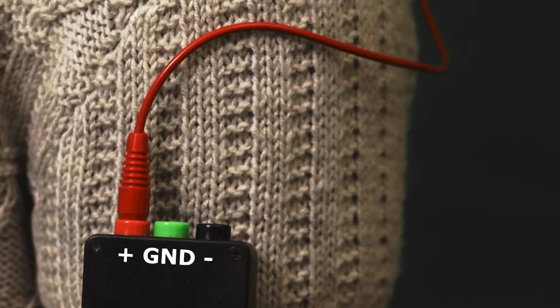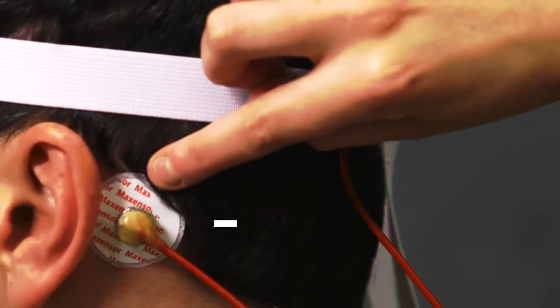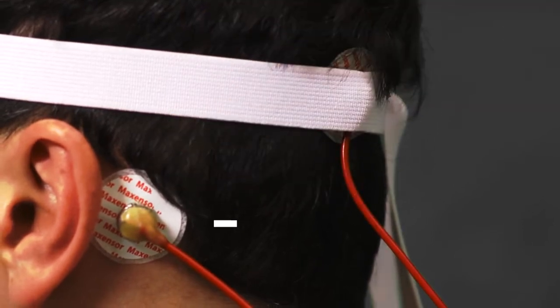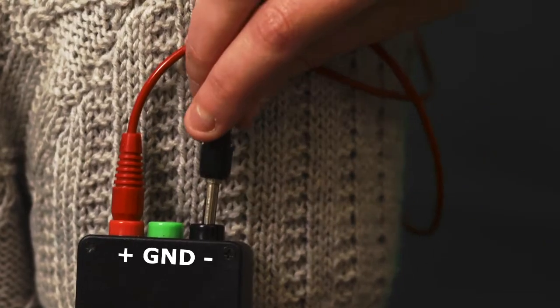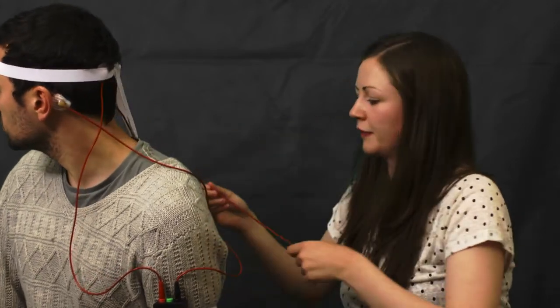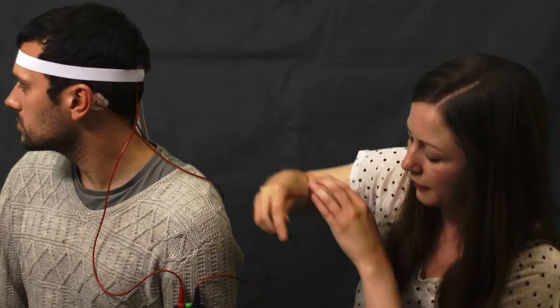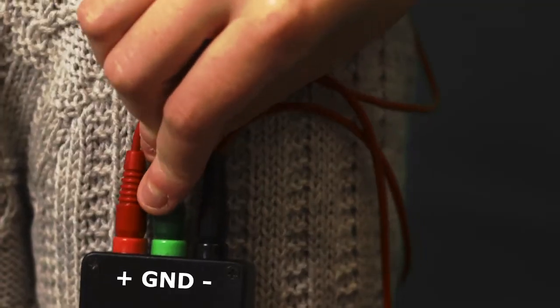Our negative is going to the same side of Jamie's head, on the left-hand side, to the mastoid position behind Jamie's ear. Our final connection is our ground. We could connect the ground to lots of different places, but we want to try and avoid recording ECG from Jamie's body. So we're going to record from the right-hand side mastoid, just behind Jamie's right ear.